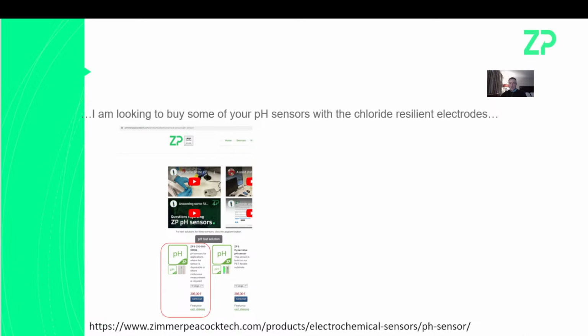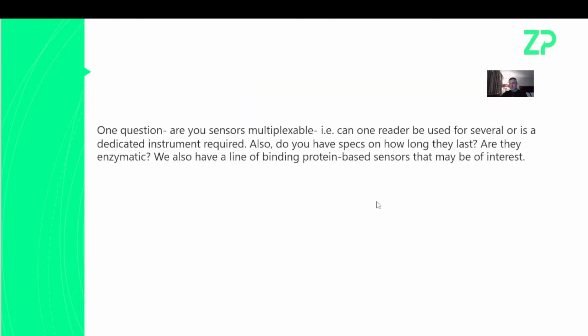It says here that in the first 500 seconds, the detection of an analyte is not reliable. This is really something we have to cover in the workshops, but in the first 500 seconds, we let it equilibrate. If we were trying to do what's called an SMBG, a self-monitoring blood glucose reading, where we make a sensor to detect glucose in a drop of blood, that has to happen in 5 seconds. The 500 seconds that you're seeing is because that sensor has been configured for continuous glucose monitoring. If we had a different application, measuring just a drop of blood, then we would use a different configuration of sensor.